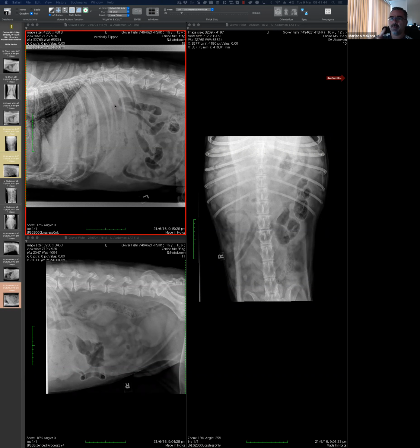So before I give you the answer, it would probably be a good idea to think about this: if you are in the best of the worlds and you have all the money, and the owner tells you, "I want to do everything I can to make sure that I don't send the dog to surgery and then you need to euthanize on the table." What would you do? I think an ultrasound exam would be useful, or a CT, or even both.